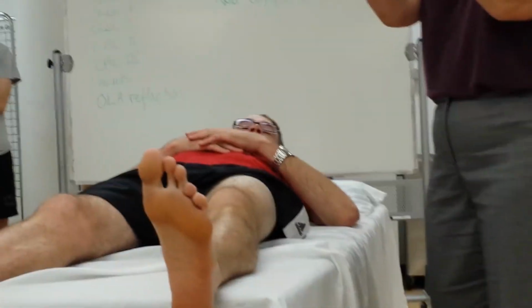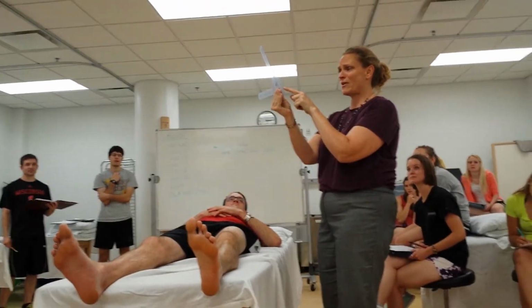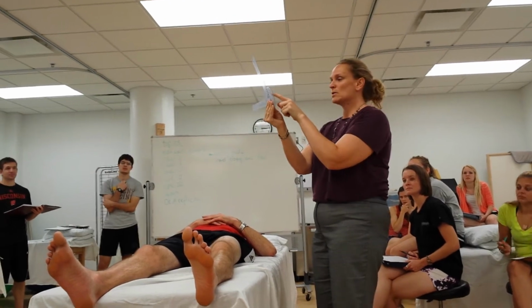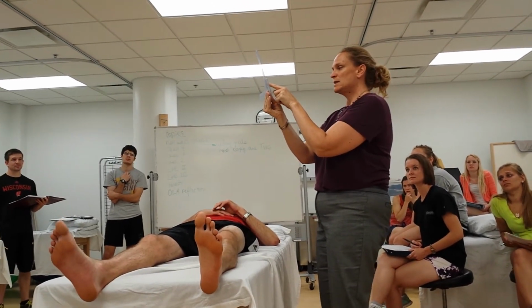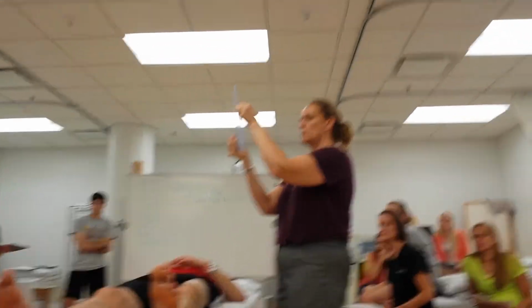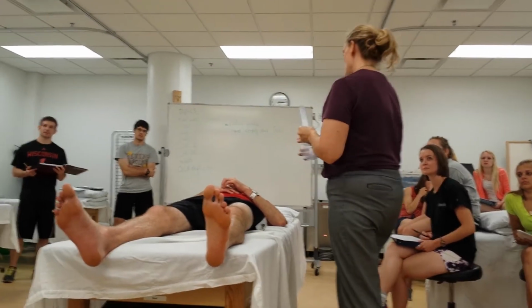Now, I know I started here and went all the way around, so my goni's reading 65, 66, 64. That's not right, right? So it's 90, 100, 110, 116. Because we started here and went past 90 that way. Okay? Normal is 120. It's not bad.